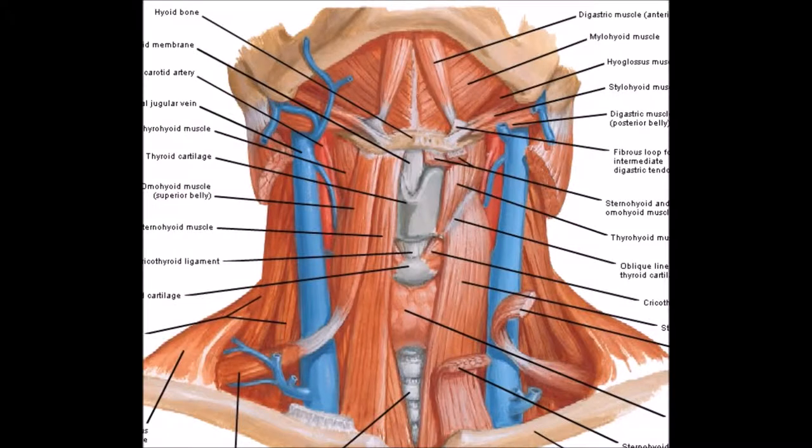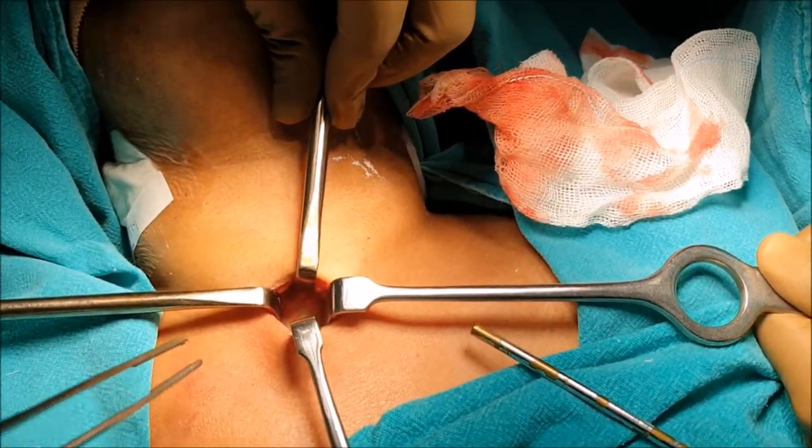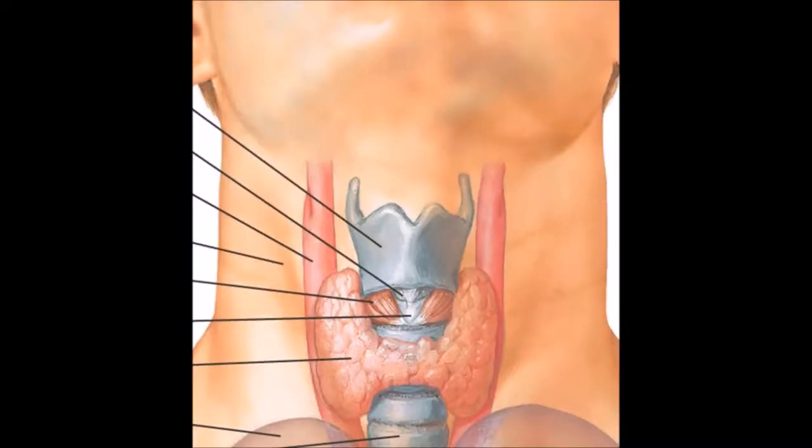Once the strap muscles are retracted, the thyroid isthmus comes into the picture. The thyroid isthmus is retracted superiorly with the help of Langenbeck's retractor.